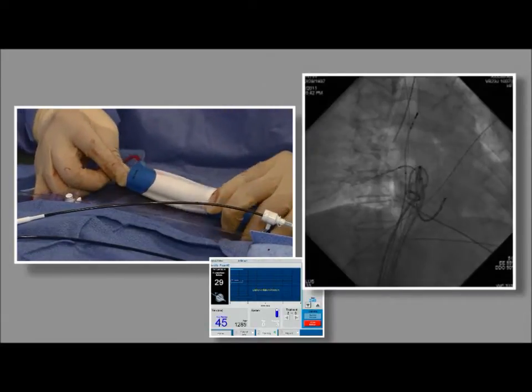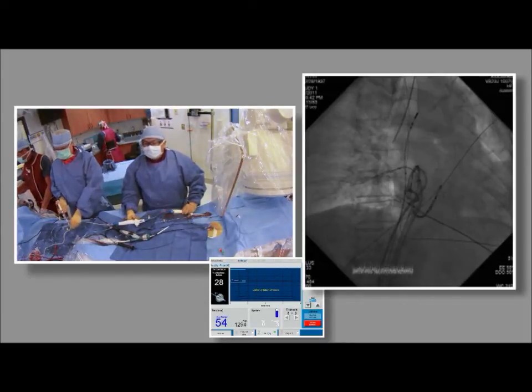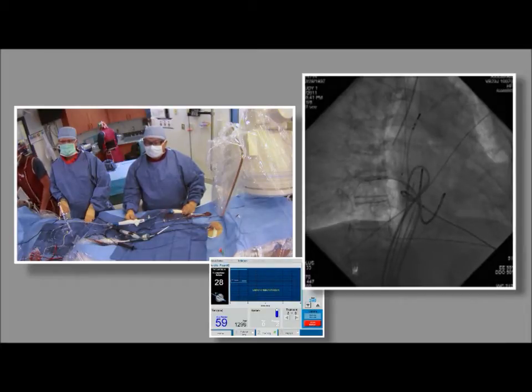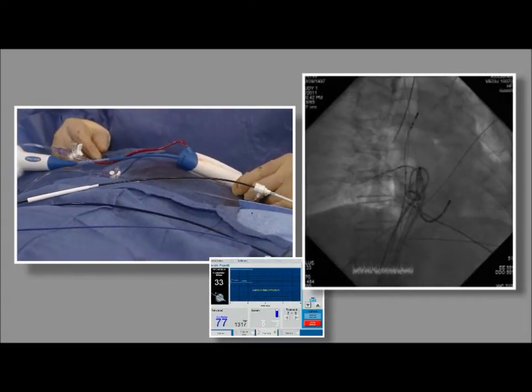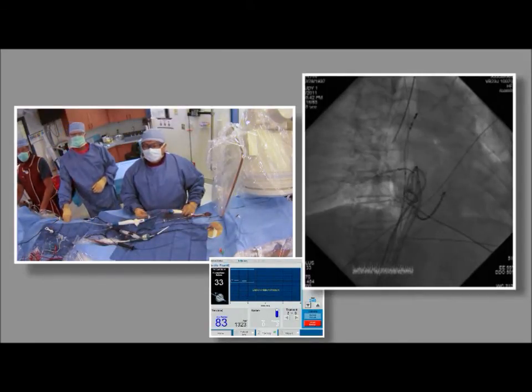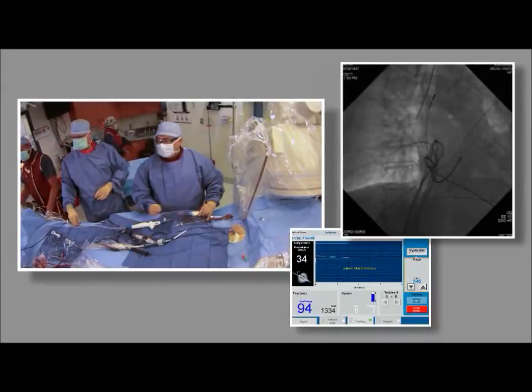As I see an inferior leak, I'm going to pull that down. I'm covering most of it that way. Looking for other branches to see if there are any other targets. I pulled the balloon down to try to create a better seal. If I come on ablation here, this will be ablating near the ostium and the carina area, which is fine. Keep in mind where the ablation is and what angle we can go at. Let's make sure we haven't changed our angle, then come on ablation.